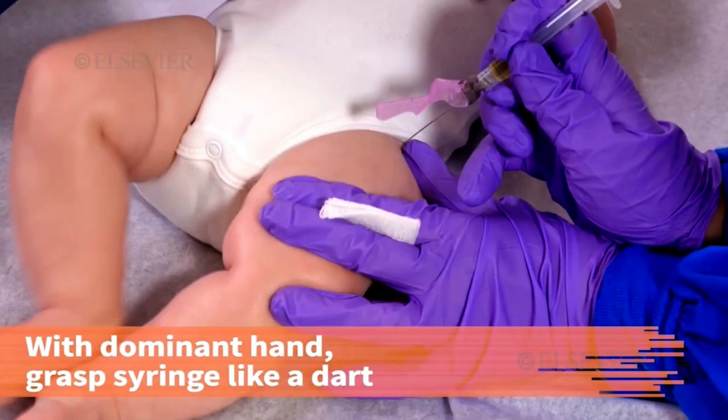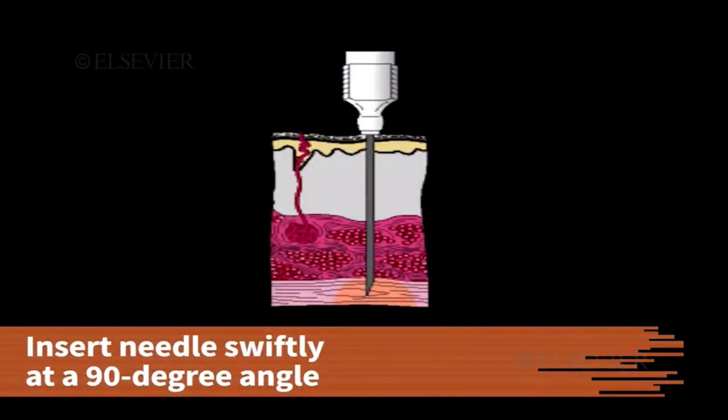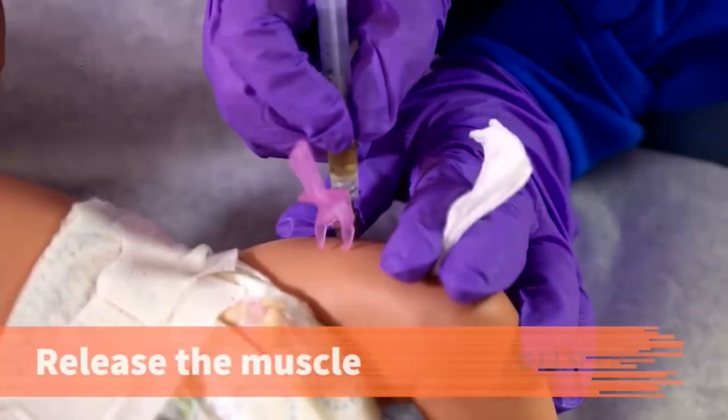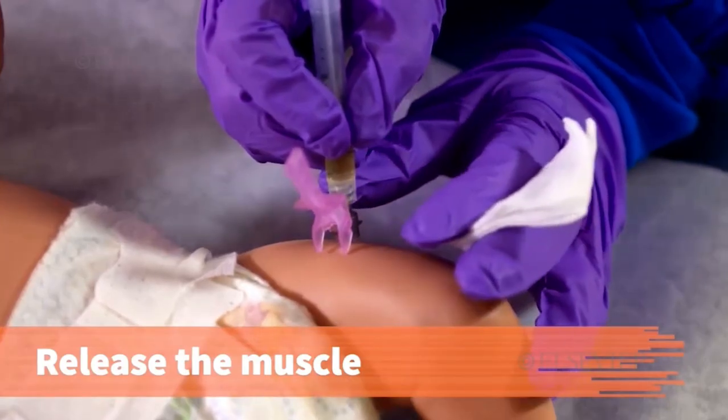With your dominant hand, grasp the syringe as you would a dart and with one swift movement, insert the needle at a 90 degree angle into the muscle. After the needle has been completely inserted into the skin, release the muscle that you are grasping.